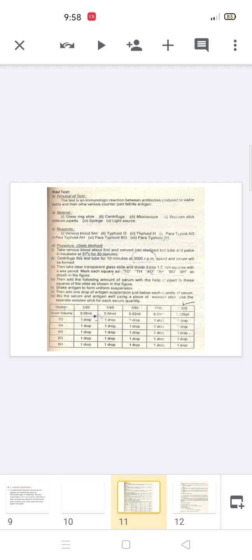If the IgG line gives discoloration or is colored, we can say the IgG antibodies are present against the salmonella. If the line for IgM has become colored, we say that the antibodies are IgM.